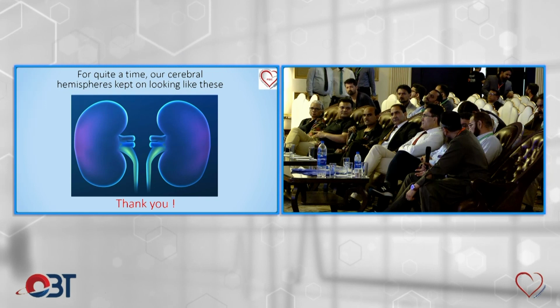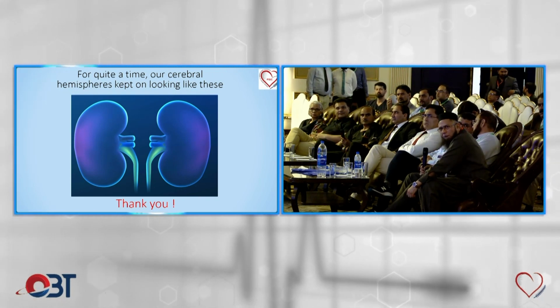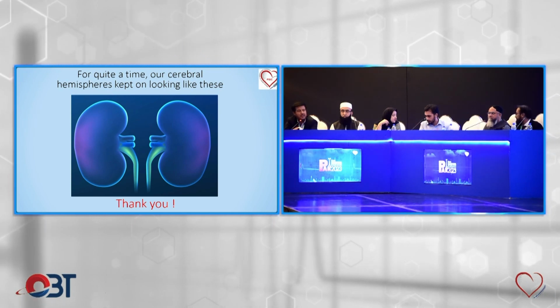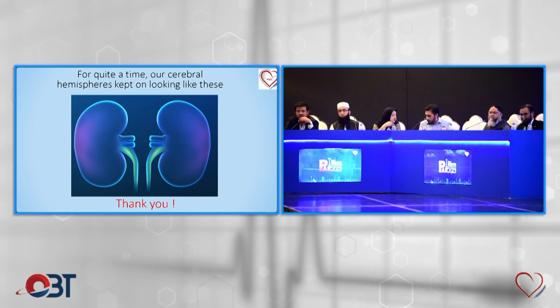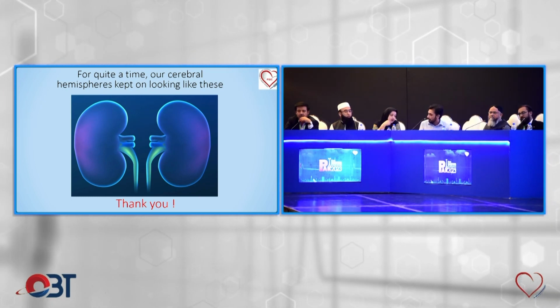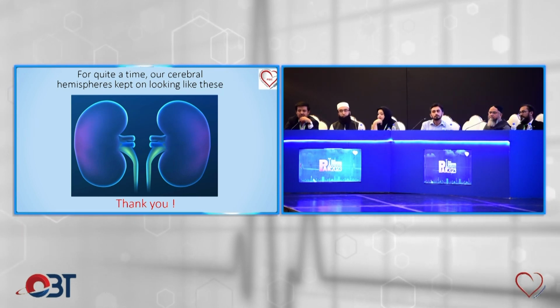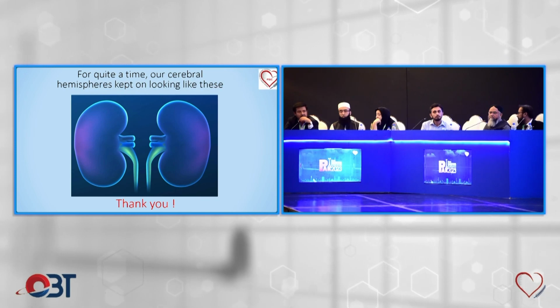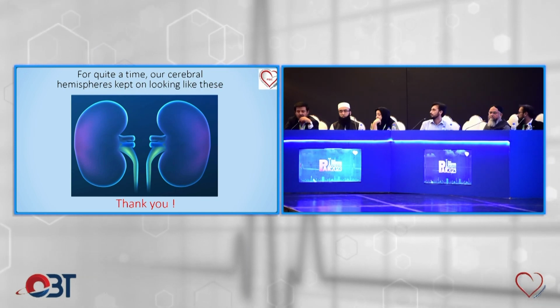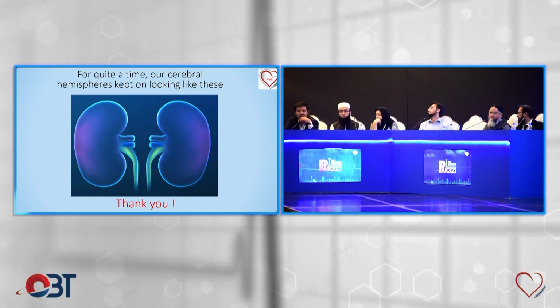So one teaching is that once you are talking about a zero contrast procedure or low volume procedure, make the procedure a simple one and plan it properly so that you can avoid a 2-stent strategy and avoid a larger guide catheter. Because the higher French you use, the more contrast you will inject to delineate the coronary arteries.